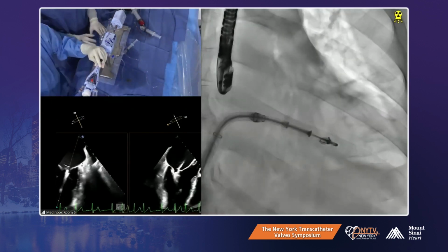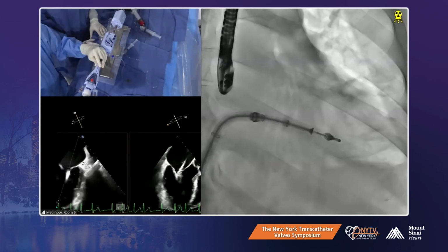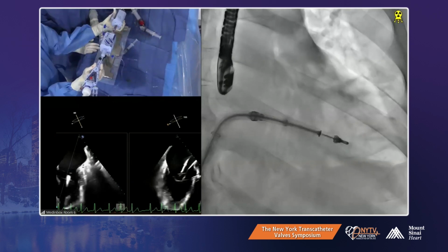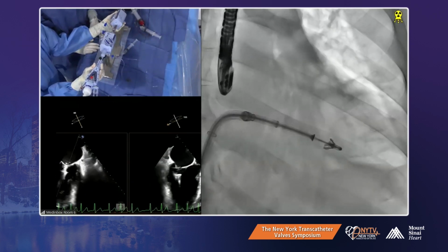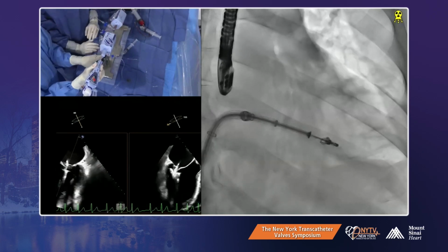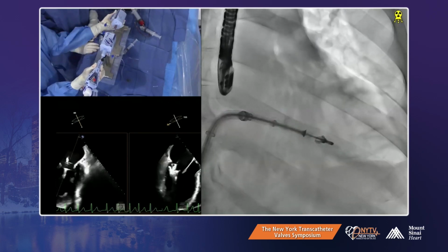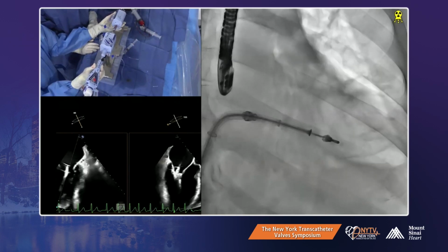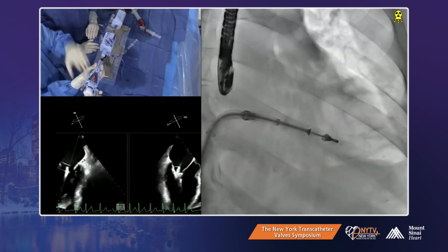Take the posterior leaflet off, center the valve, bring it back to the atrium and see if we can get a better trajectory. Try more plus. No, we had a lot of plus. We do right now. Okay, now it's better, I think. Everything is falling into place, yeah. Ready, ready, ready. Coming back.